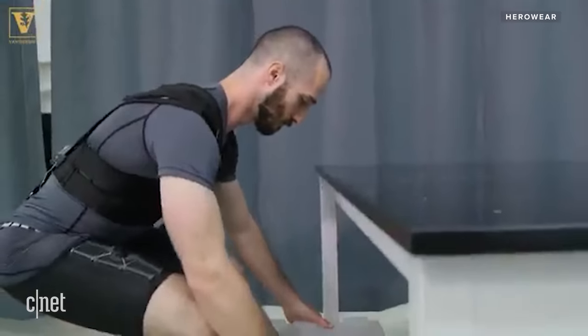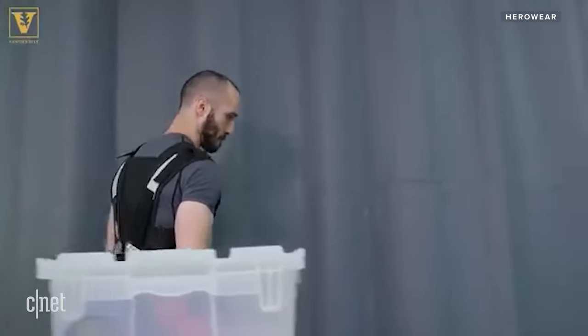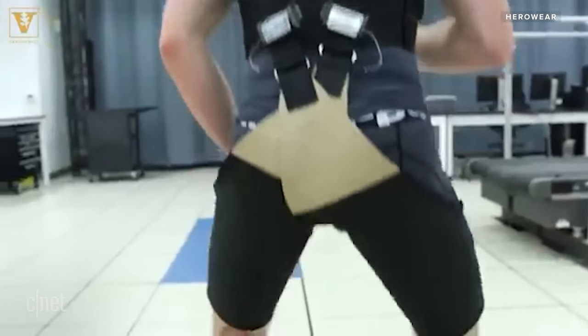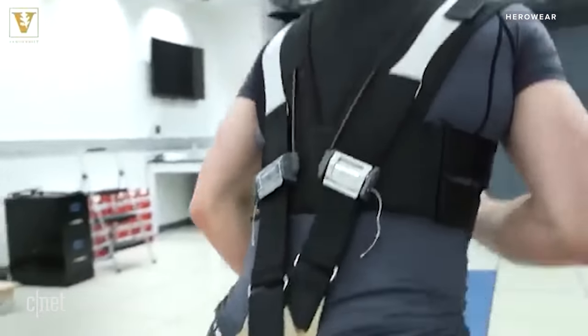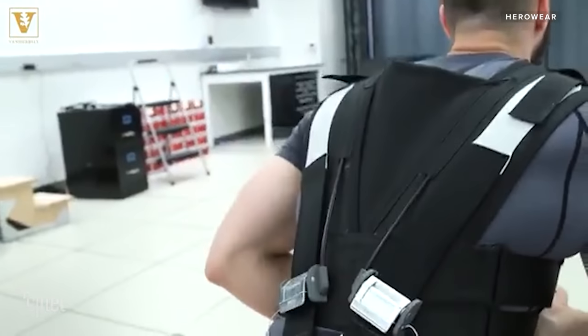They went back to the physics, drawing models and figuring out the dynamics. Mathematically, they determined you don't need a rigid structure — you should be able to offload the back using soft elastic elements. Carl and his students developed a few early prototypes before reaching the design that would ultimately become the HeroWear Apex.